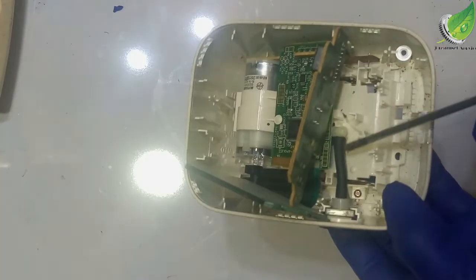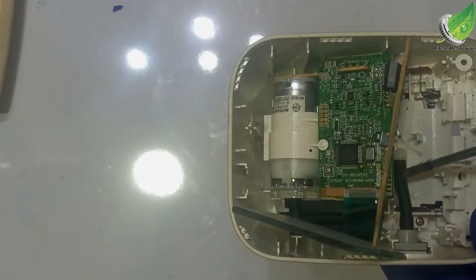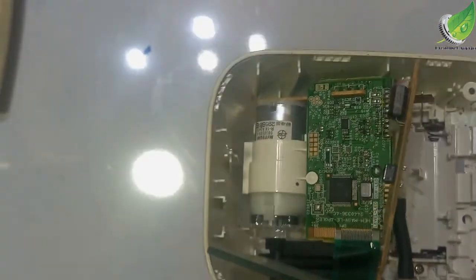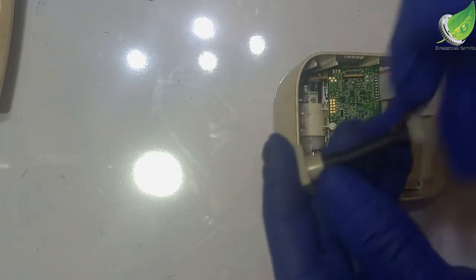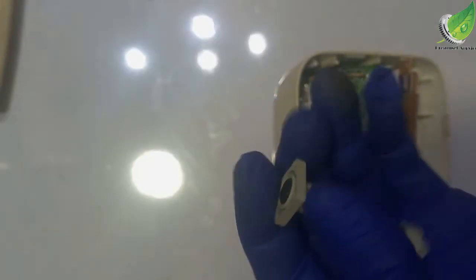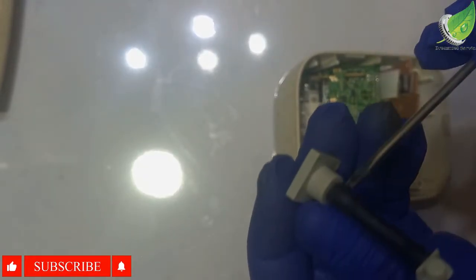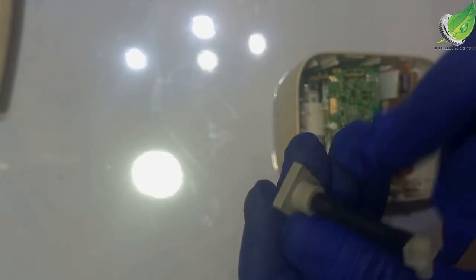So what I want to do is to check this valve here. It's either that it has lost its consistency or is now loose and allowing air to escape. So what we'll do is to remove this and replace it with another one. So there's a slight tear here. So I'm going to replace this.